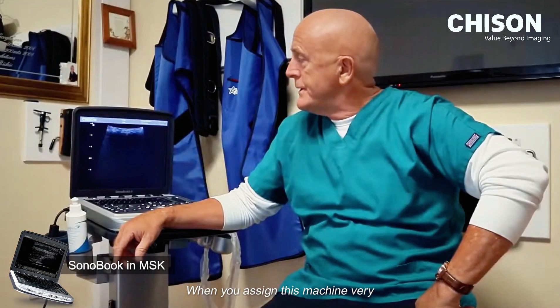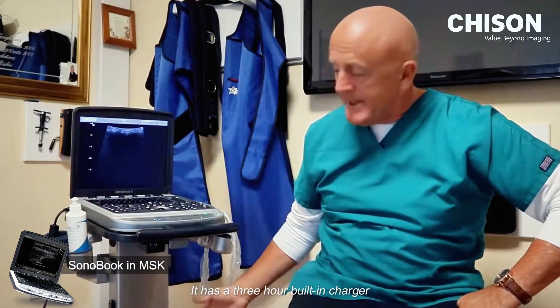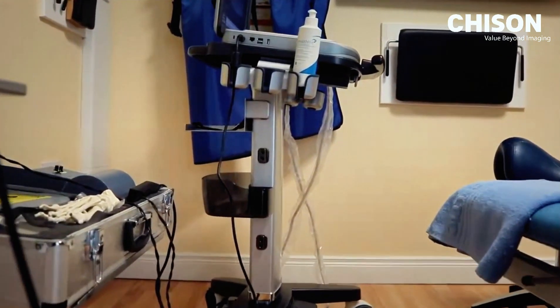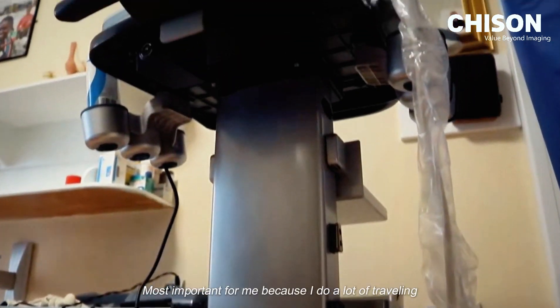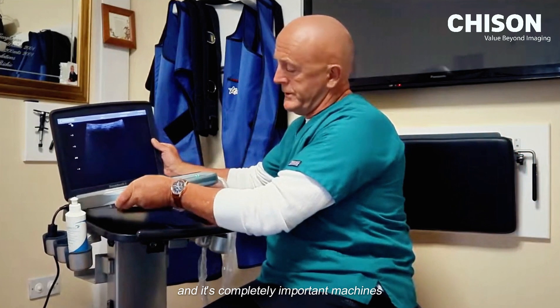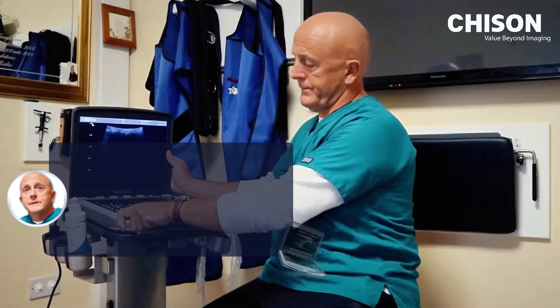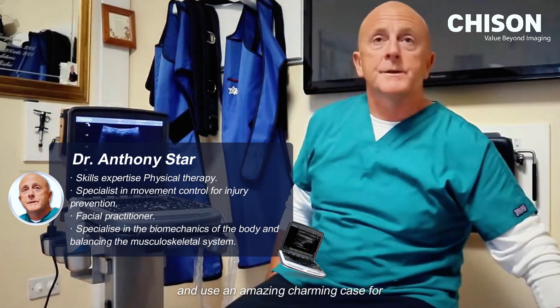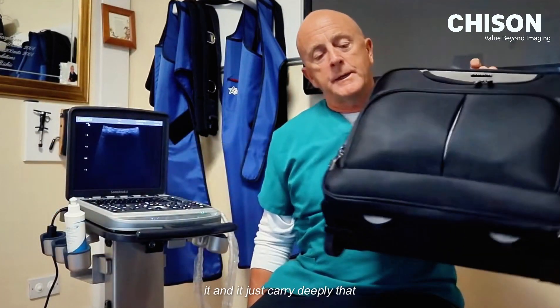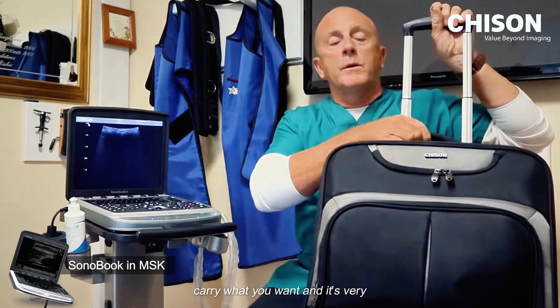Why I find this machine very beneficial is, one, it's great for the practice environment. It has an amazing trolley and a three-hour built-in charger into the base of it. Most importantly for me, because I do a lot of traveling, it's completely portable. You just slip it off and dismantle it, and there's an amazing travel case for it — you can wheel it or carry it wherever you want. It's very convenient for use.